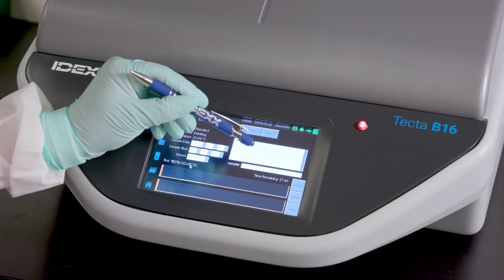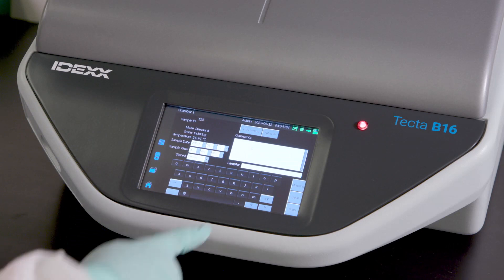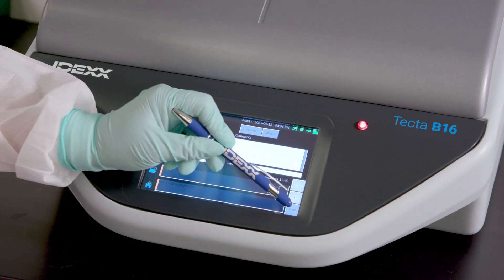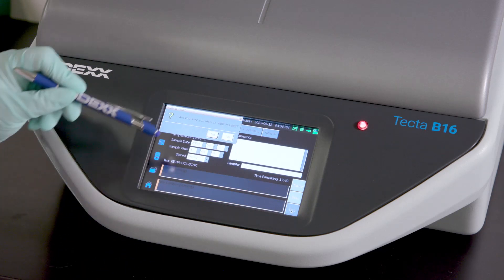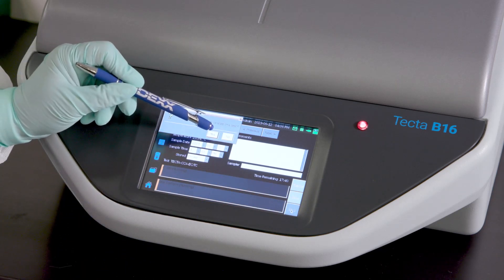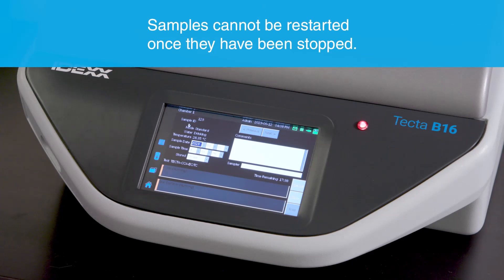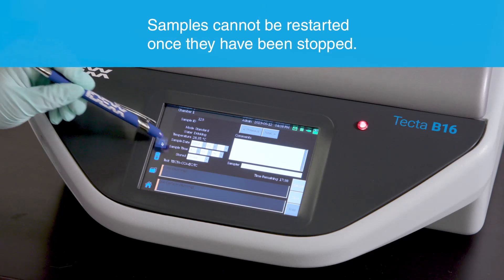Clicking on the comment box will prompt a virtual keyboard to appear. A USB keyboard may also be connected to the instrument for easy text entry. Samples can also be stopped from this screen at any point in the test. Press Yes to confirm that the test should be stopped — this will show the chamber as yellow and will report the test as cancelled. Once cancelled, the sample cannot be restarted.